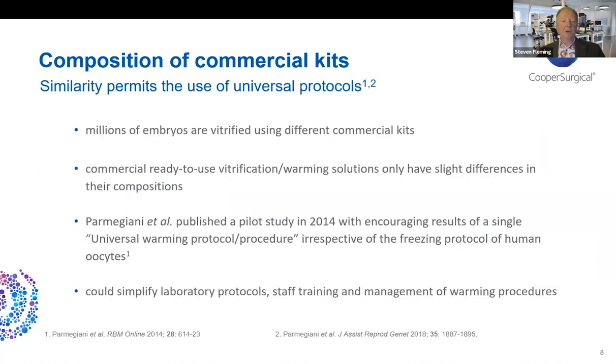And of course, there are many cells and tissues still stored within cryobanks around the world that have been vitrified or slow frozen. And many clinics still receive samples from other centers that were cryopreserved using different kits and protocols. So in this case, the possibility of using a universal warming protocol can simplify the management of the warming procedure.